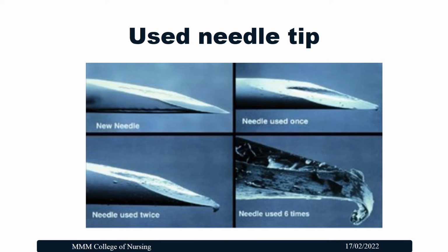At this point, I want to insist that all needles are supposed to be used only once, because when we use them several times, the needle will be blunted and it will cause more pain and tissue injury to the patient. In this picture, we can see the needle before usage, it is very sharp.